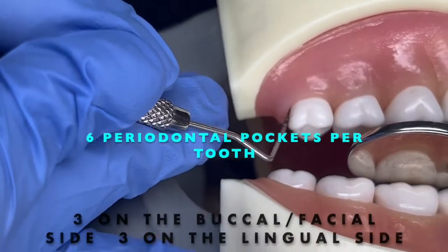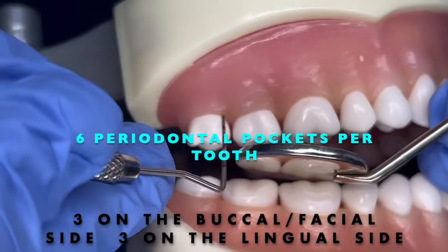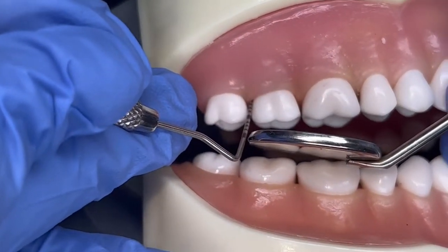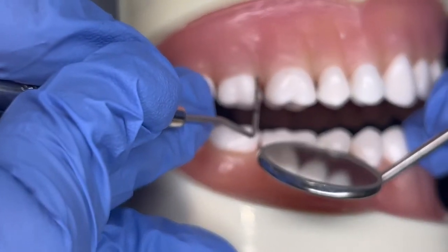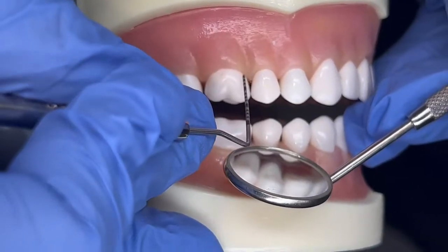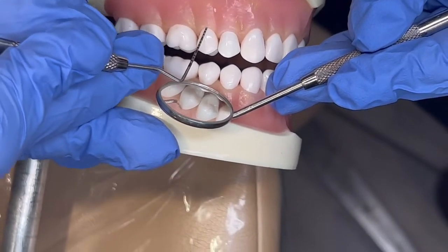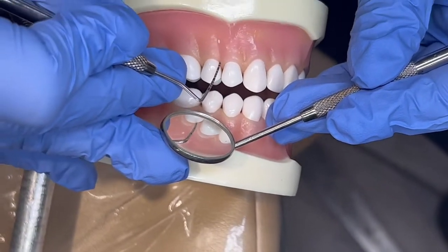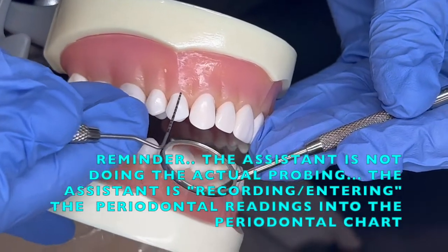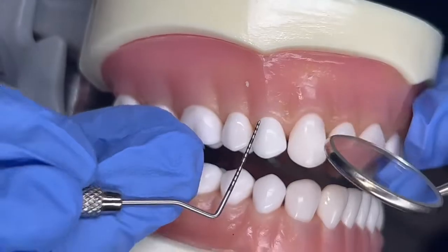On the molar distal buccal we got an 8, direct a 7, mesial a 7 — so 8, 7, 8. Then numbers continue: 1, 4, 2, 5, 3, 2, 2, 3, 2, 2, 3, 1. The probe is being inserted, going between the gum until it hits bone and stops.